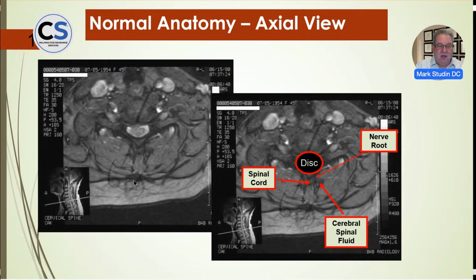In our world, you need an appropriate number of sequences and slice thicknesses. That's critical. And we're not going to really have an opportunity to talk about sequencing in either today or the next conversation, which we're going to jump out in just a moment. But sequencing is critical. You need a T1 image, you need a T2 image, and you need a STIR image at the very least. You need proton density images in many issues. There's water suppressed, there's fat suppressed. There's so many different things, and it's really not that difficult, but you need at least 2 clean slices through the disc, not catching the bone, and that's really important.